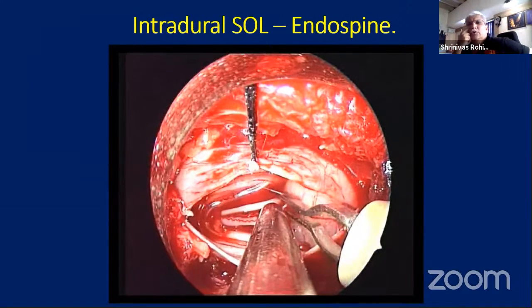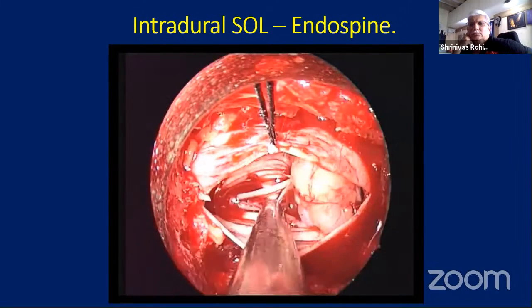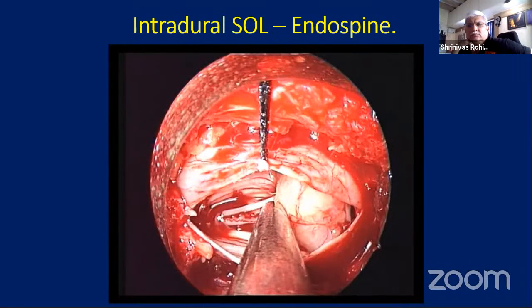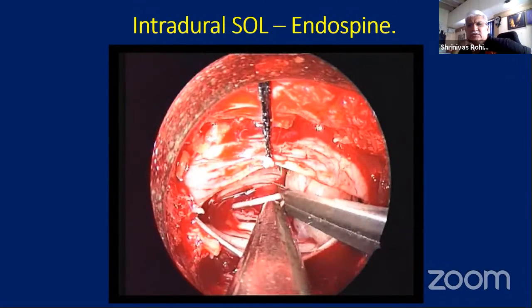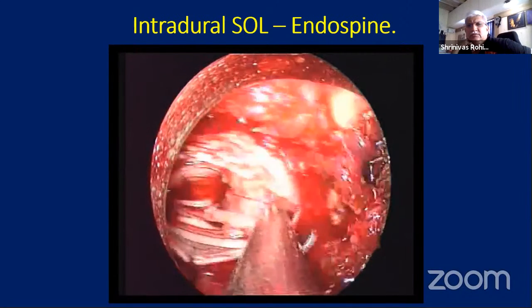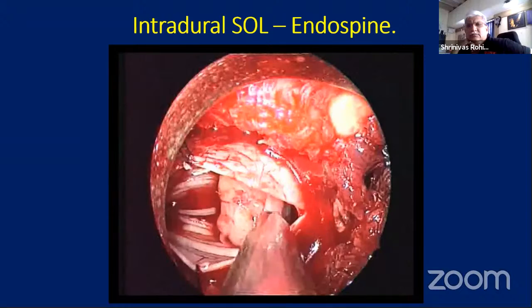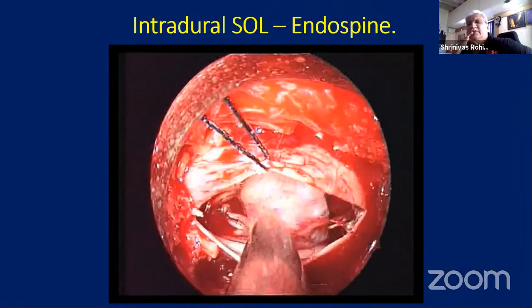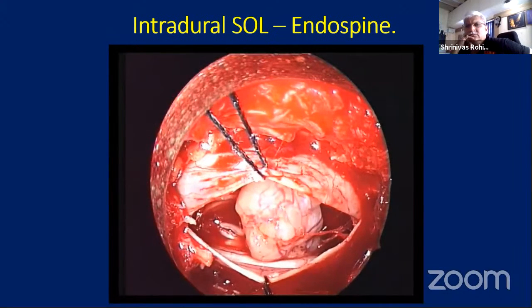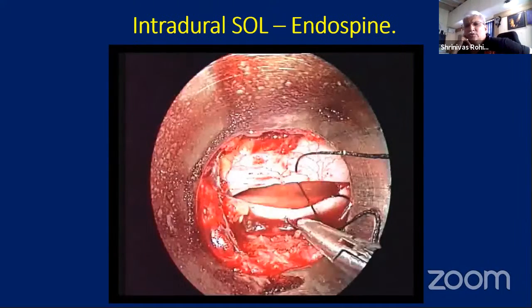Now this is an intradural tumor also. This is a neurofibroma. You can use micro scissors. And the thing is, same incision, no drain, no catheter. We mobilized this patient after 2 hours and discharged the next day. And this is the dural closure with anastoclips.